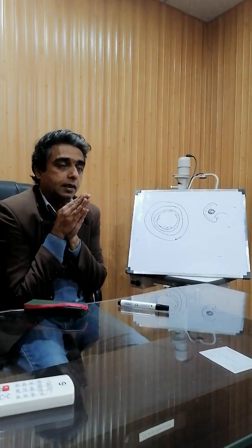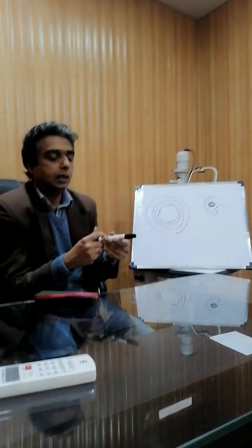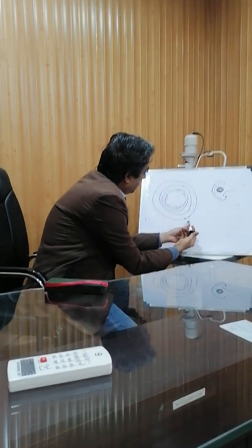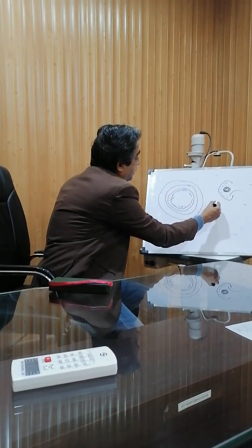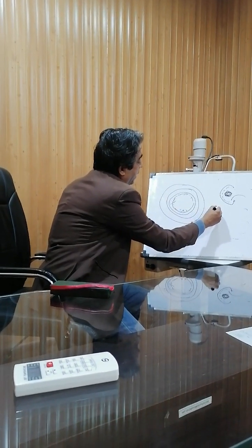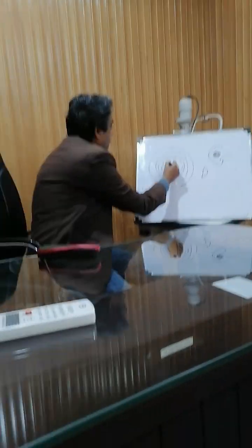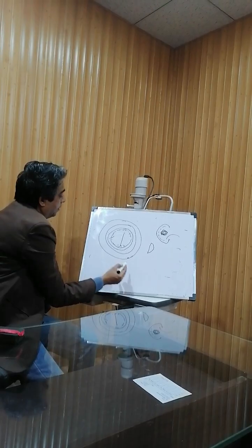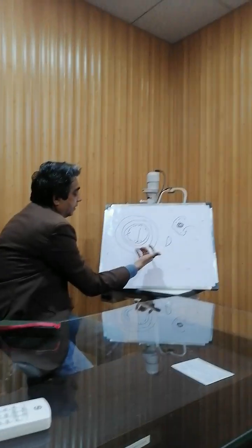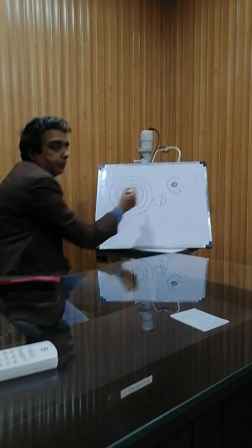It is inserted into an injector like a syringe. Sometimes it is preloaded, sometimes we load it ourselves, and it goes inside the eye. It looks like this lens. This lens will go through this small incision. You will inject the lens and it will open up, it will go into the eye.